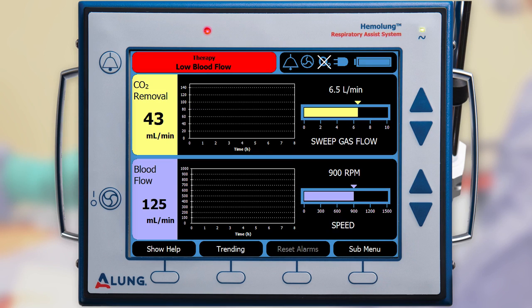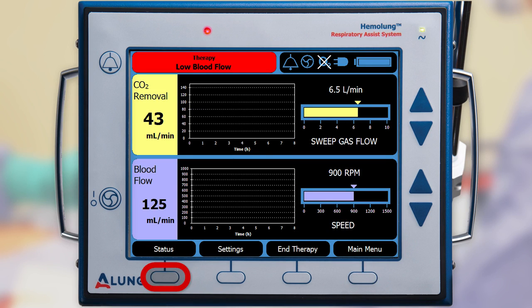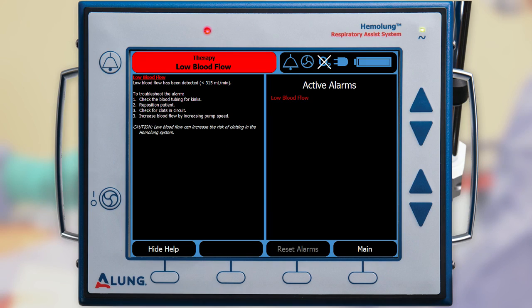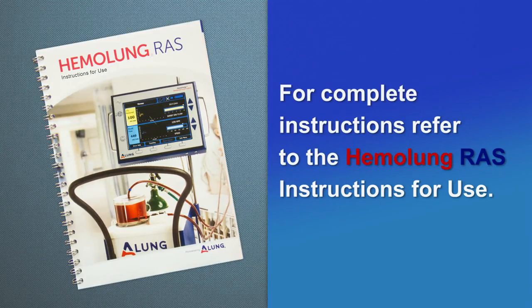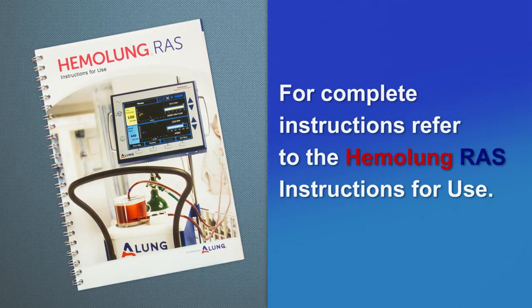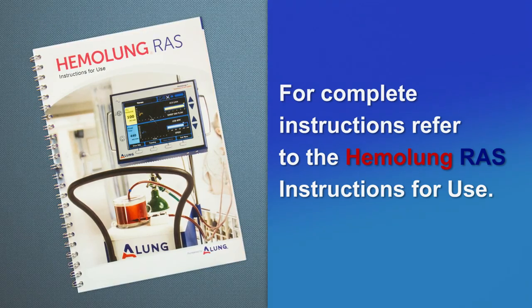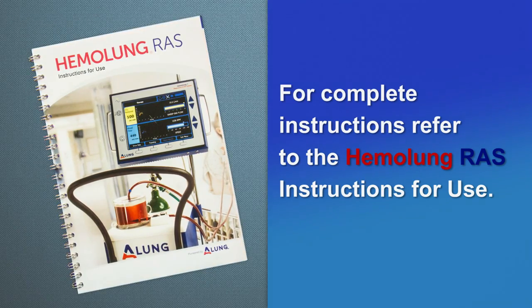To view all active alarms, press submenu followed by status. To view alarm help text, press Show Help. For complete instructions, refer to the Hemolung RAS instructions for use.